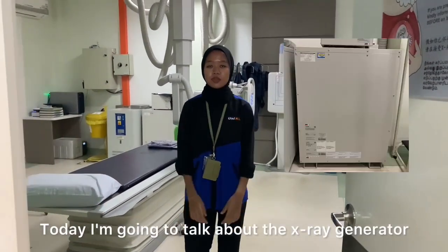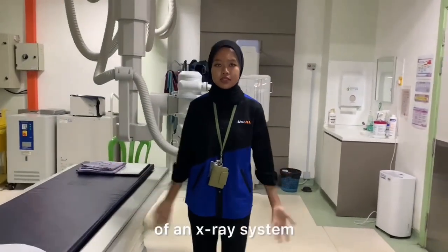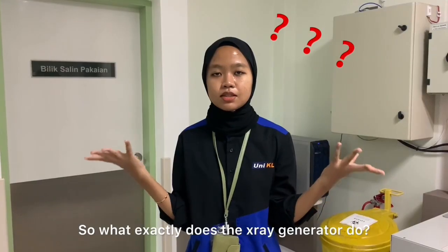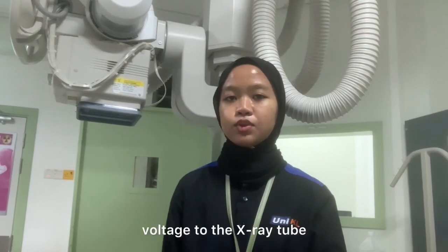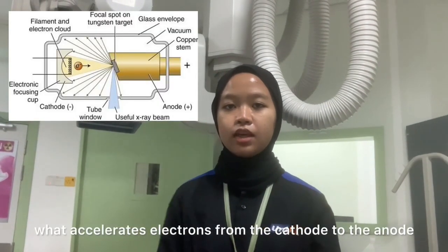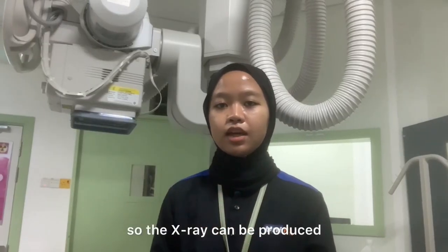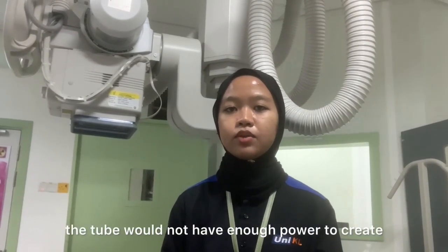Today I'm going to talk about the X-ray generator and why it's one of the most important parts of an X-ray system. So what exactly does the X-ray generator do? The generator's main job is to provide high voltage to the X-ray tube. This high voltage is what accelerates electrons from the cathode to the anode, so the X-rays can be produced. Without the generator, the tube will not have enough power to create any radiation at all.